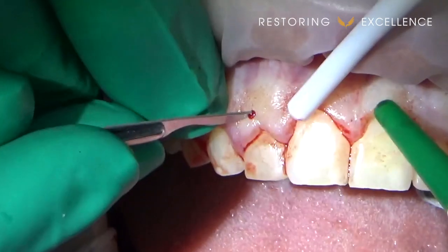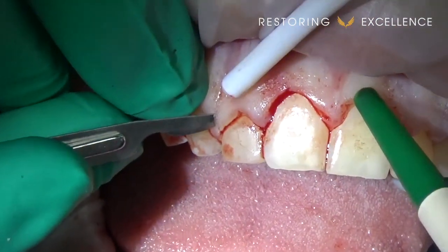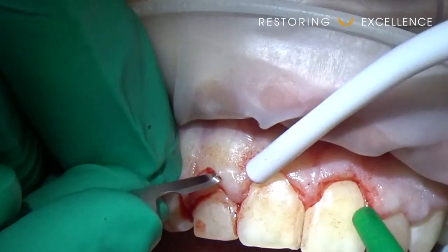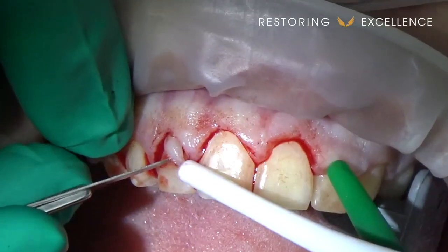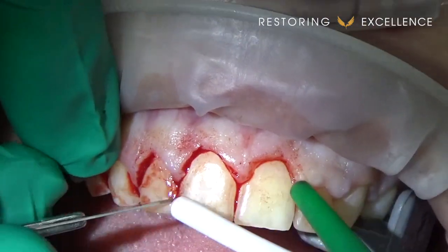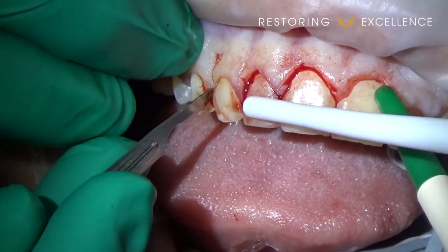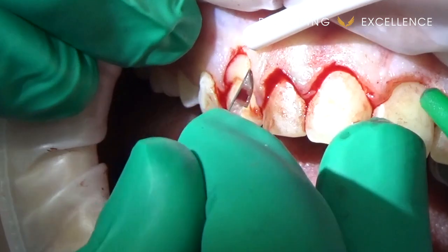I was not happy with the stent, so after careful measurement I free-handed the incisions. I'm not using a beveled incision — I've really got the scalpel at 90 degrees to the surface.